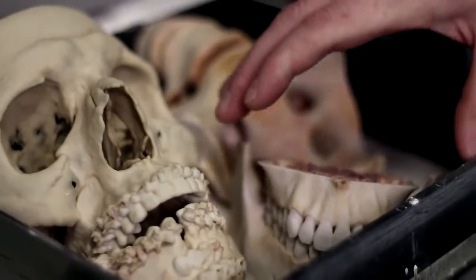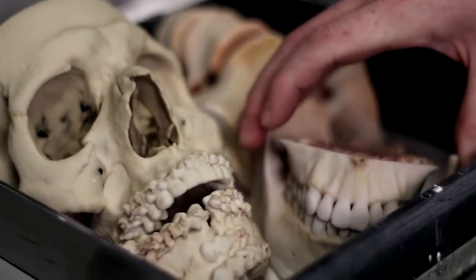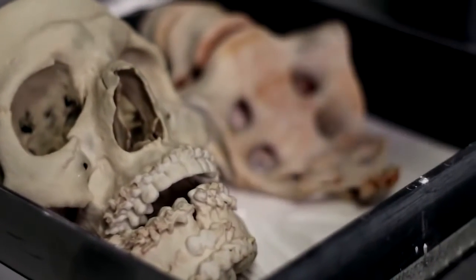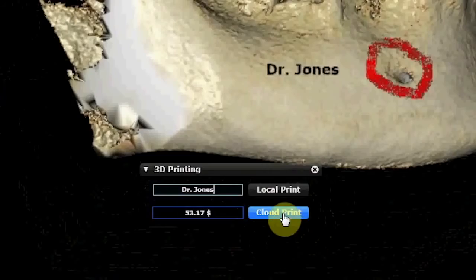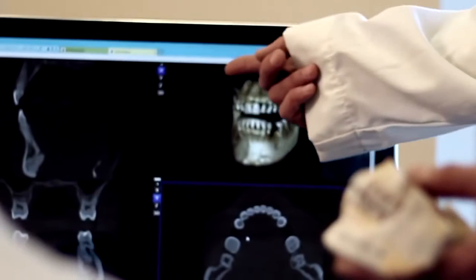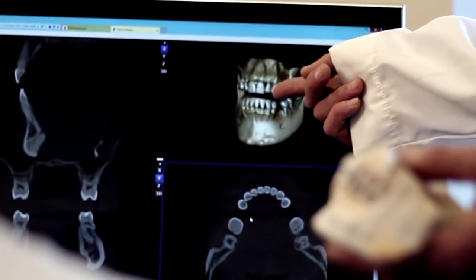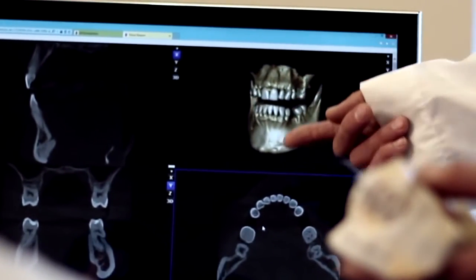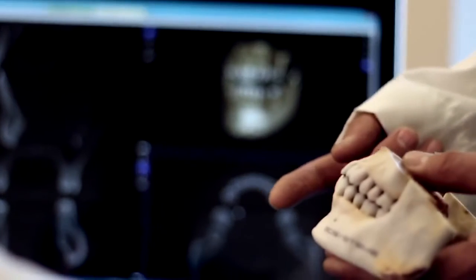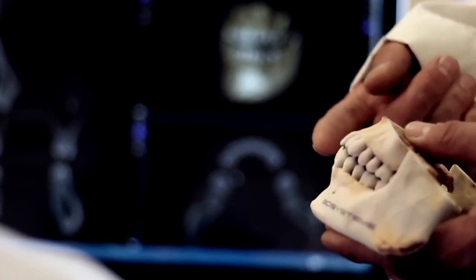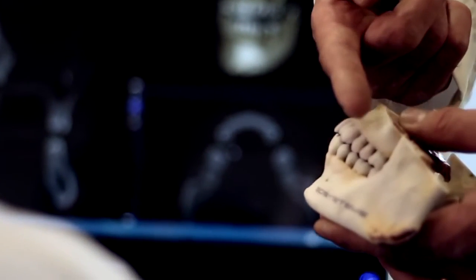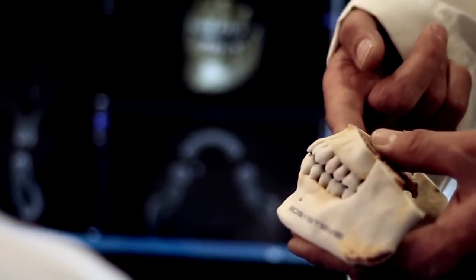You can 3D print your models at your local reseller or through 3D Systems' online ordering service. Within days, you will have a stunning demonstration piece to better explain a procedure to your patient or for surgical practice.